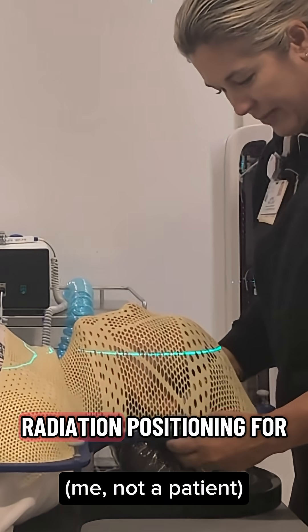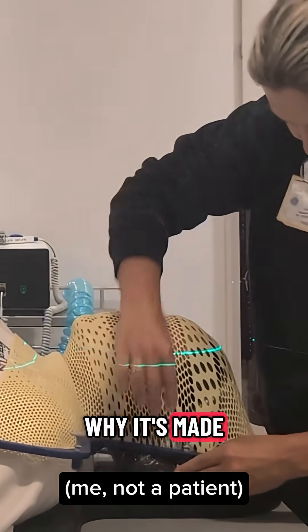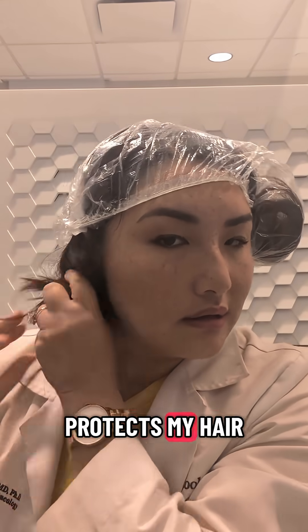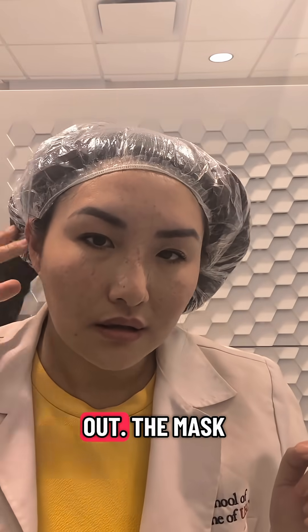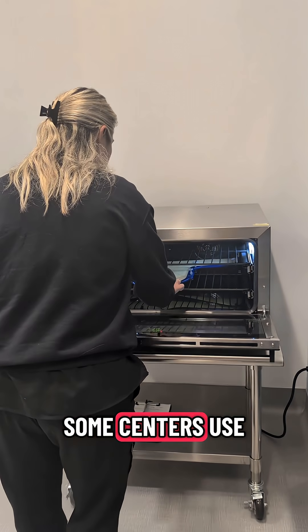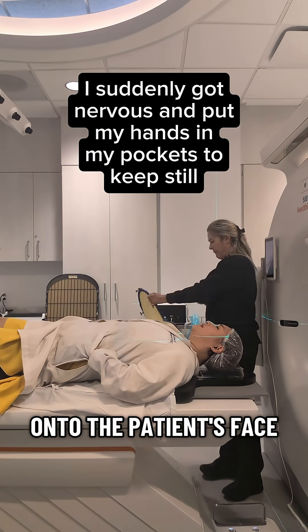One of the scariest parts of radiation positioning for many patients is this mask, so today I want to talk about how and why it's made. First step: the CT simulation, or mapping scan. My radiation therapist April protects my hair with a shower cap so that the melted plastic of the mask doesn't end up sticking to it and pulling any out. The mask is heated in a chamber until it's soft and flexible. Some centers use a water bath, but we prefer this method because it keeps water from getting onto the patient's face.